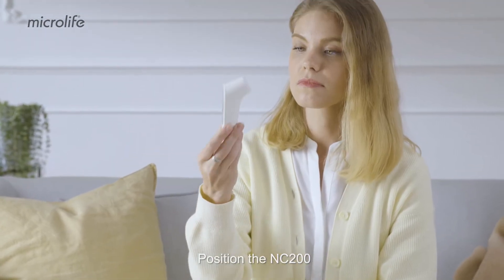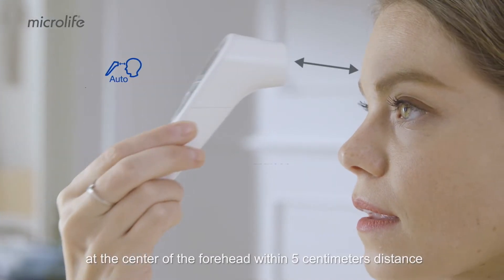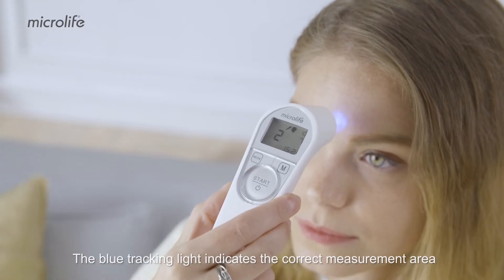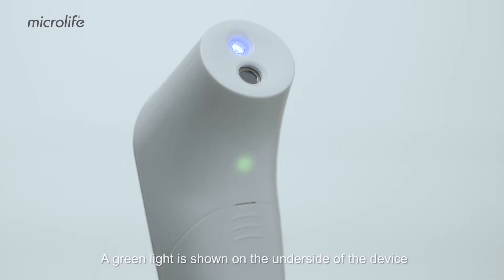Position the NC200 at the center of the forehead within 5 cm distance. The blue tracking light indicates the correct measurement area. A green light is shown on the underside of the device to indicate the correct measuring distance for self-measurement.